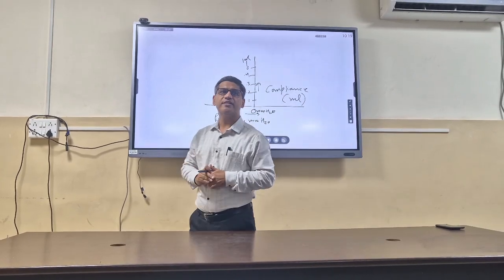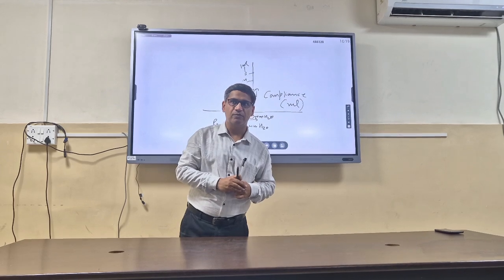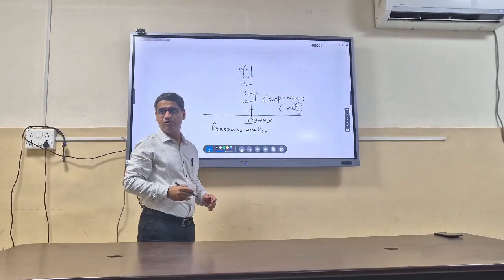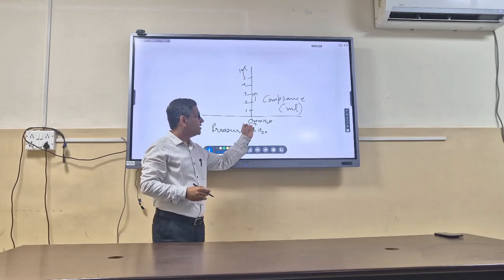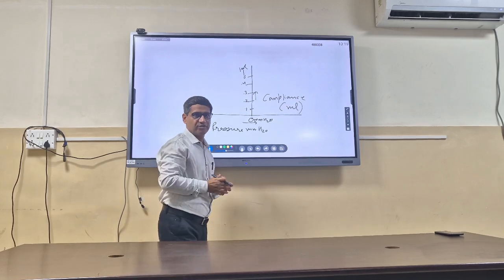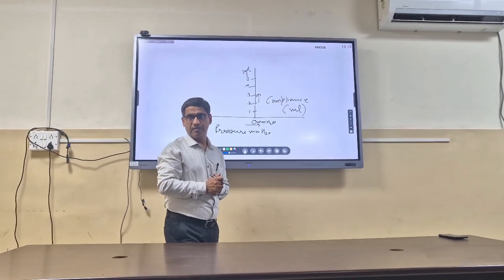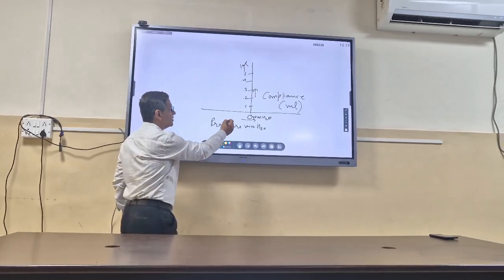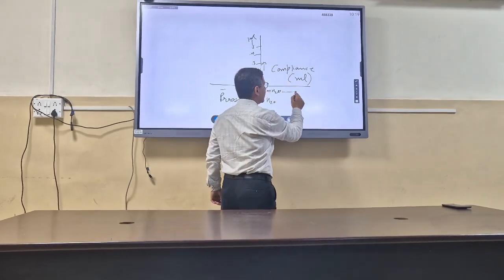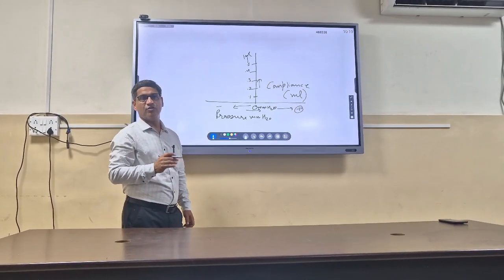It is somewhere between 0.35 to 1.4. Anyways, it falls in this range. And that comes at 0 millimeter of water pressure, which is actually the ambient air pressure, because the function of the eustachian tube is to equilibrate middle ear pressure with that of the surrounding. Any pressure on the left side will be considered negative, and any pressure on the right side will be considered positive. So clear up till now?